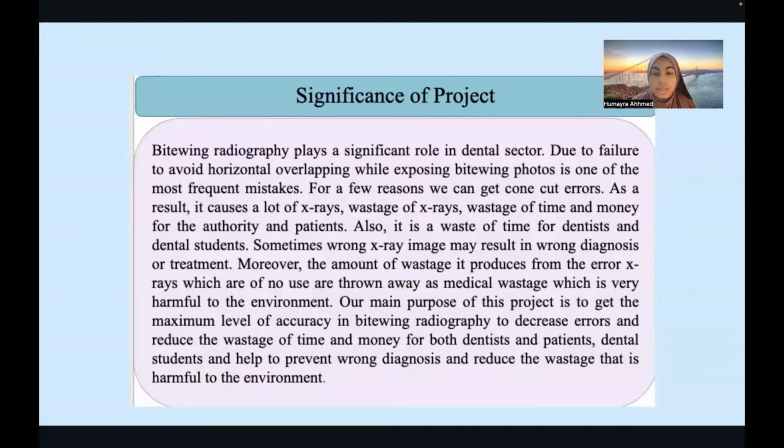The significance of our project is that Bitewing radiography plays a significant role in dental sectors. Failure to avoid horizontal overlapping while exposing Bitewing photos is one of the most frequent mistakes. For a few reasons, we can get cone cut errors, and as a result, it causes a lot of X-ray wastage, and waste of time and money for the authority and patients. Also, it is a waste of time for dentists and dental students.